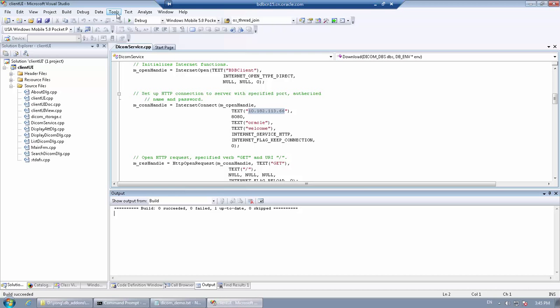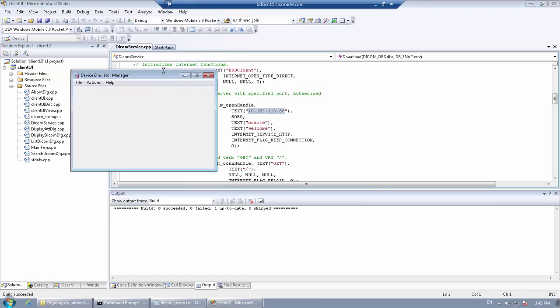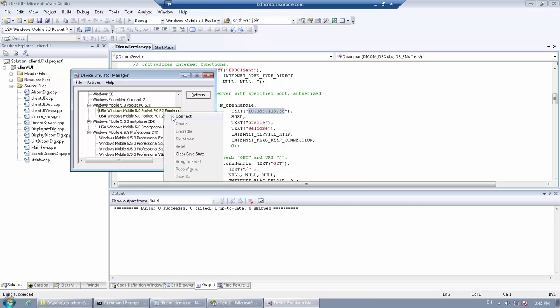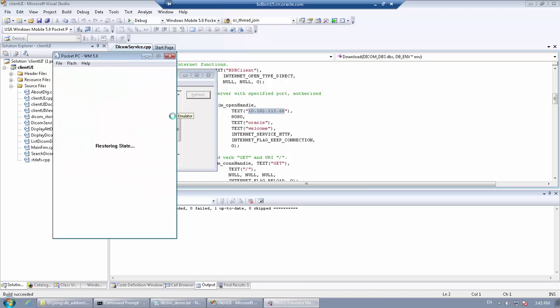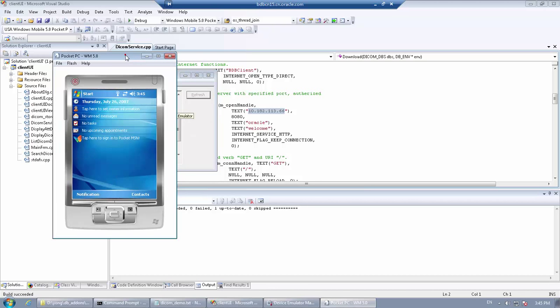After a successful build of the client program, we can run it in an emulator. Take Windows Mobile Pocket PC as an example. We connect to the emulator.